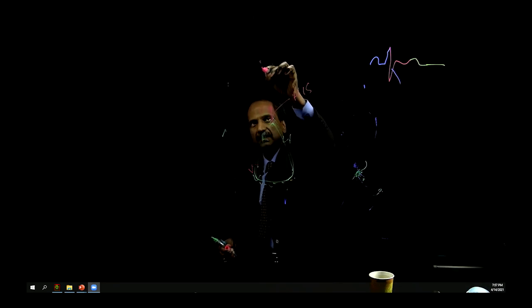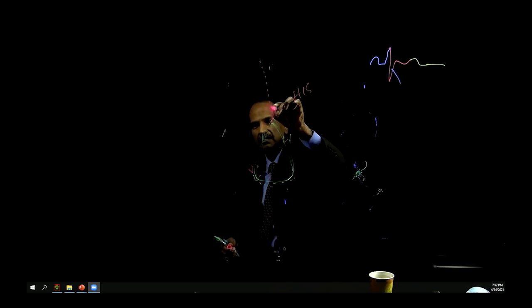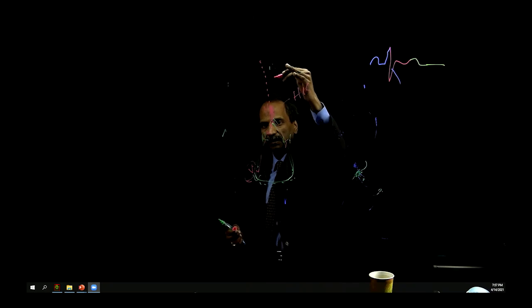Since the His is not part of the circuit, the HV in conduction with a sinus beat reaches the His and then reaches the V. But in tachycardia, we have a turnaround below the His that gets you to the His while en route to the V. So the HV is shorter during tachycardia in bundle branch reentry compared to a sinus beat. The right bundle, we're at the right level that's housing the circuit, so the intervals are the same. The His is higher, same principle. But in this case, it was exactly the same.